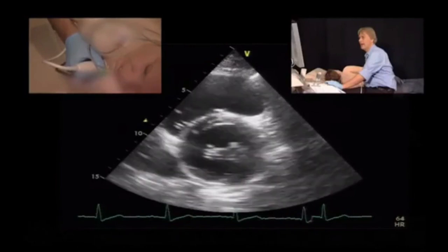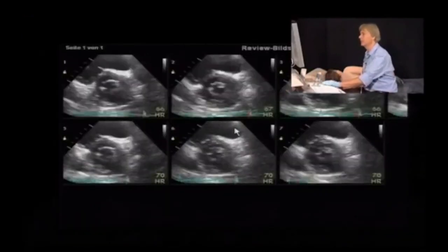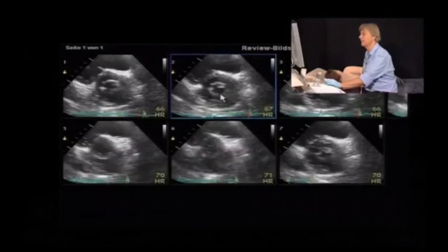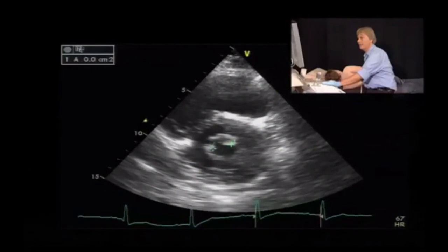Okay, and then once you have that, you would freeze the image. I will now go to the images I stored previously. Okay, this is such an image. Then scroll to the region where the mitral valve opens the largest during the cardiac cycle, and then you perform planimetry. Here in our patient, it's possible to do that quite nicely.